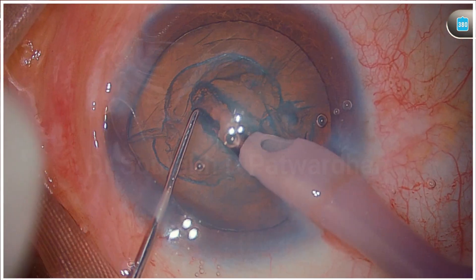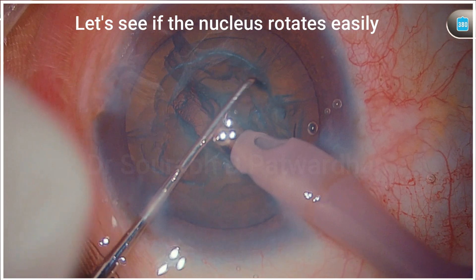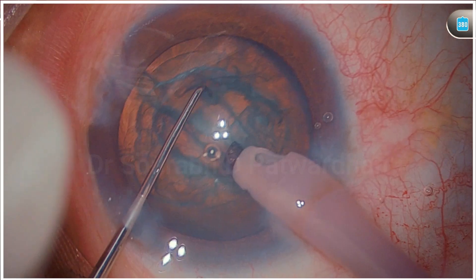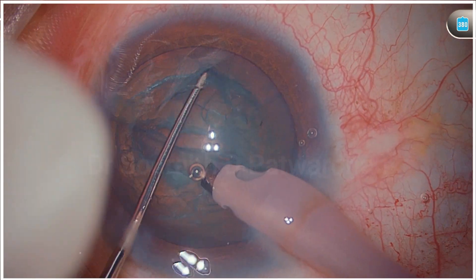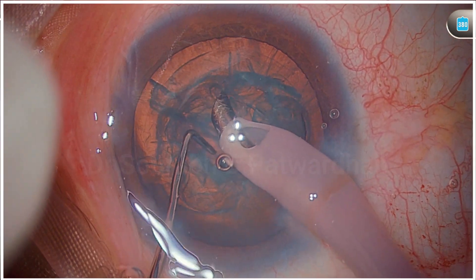The right depth is important. Now you can see that when I try to rotate this nucleus, it is not rotating that easily. When I try to rotate it further, you can see there is resistance. I am trying to do bimanual rotation here, but still the nucleus does not move easily. That is an indication that the hydrodissection has not separated the nucleus from the capsular bag.